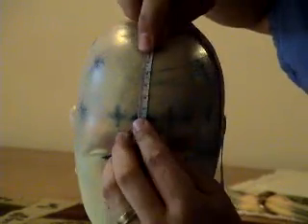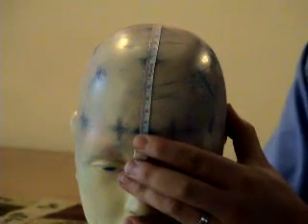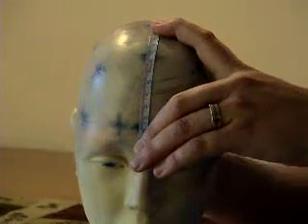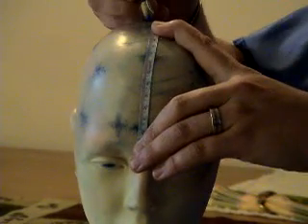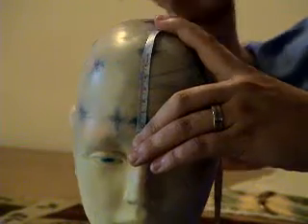After you've made those two marks, this mark will be known as FPZ, and your mark in the back will be known as OZ. The measurement between the two is 25 centimeters. So what we're going to do is take half of 25 centimeters, which will be 12.5. Make a line again across the tape.